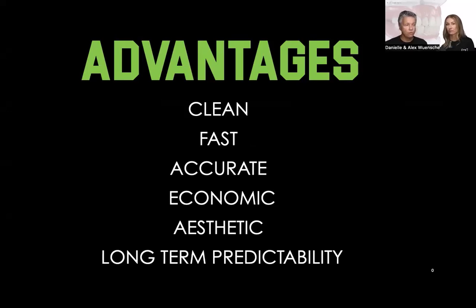Actually, we can really give the patient a fixed-feeling restoration because of the locking mechanism, but we can even have a flange because the patient can take it out for cleaning and we can hide whatever is underneath basically. And it's very long-term predictable. Yeah. So it lasts a very long time.